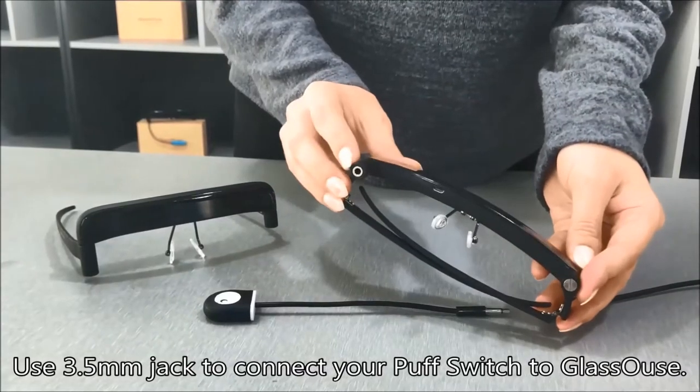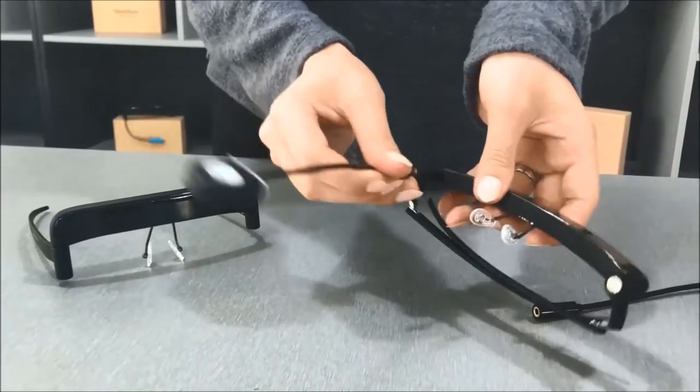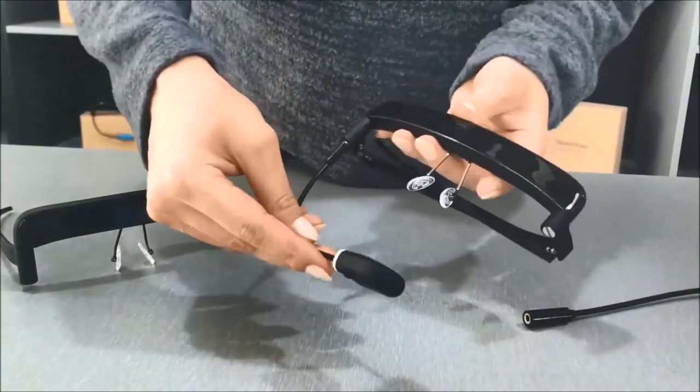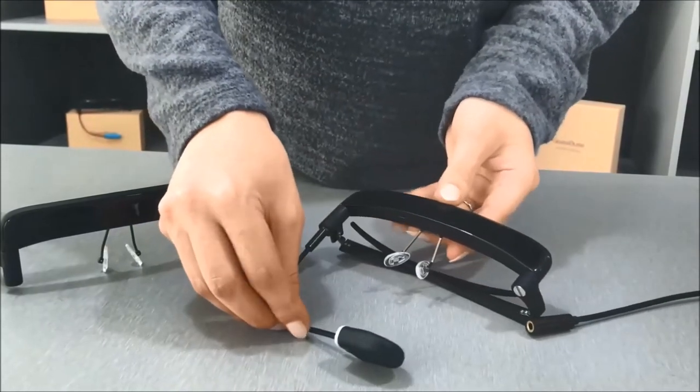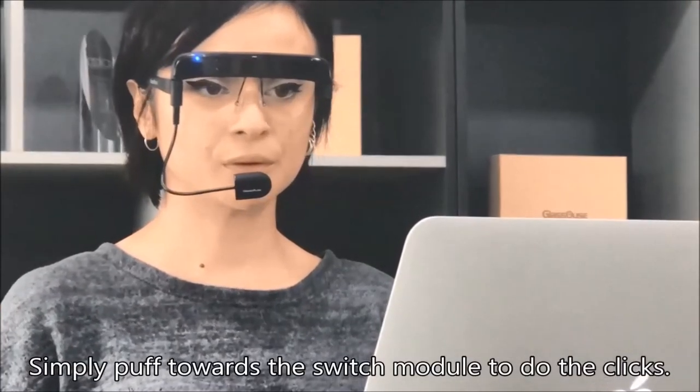Use the 3.5 mm jack to connect your puff switch to Glasshouse. Connect and adjust. Simply puff towards the switch module to do the clicks.